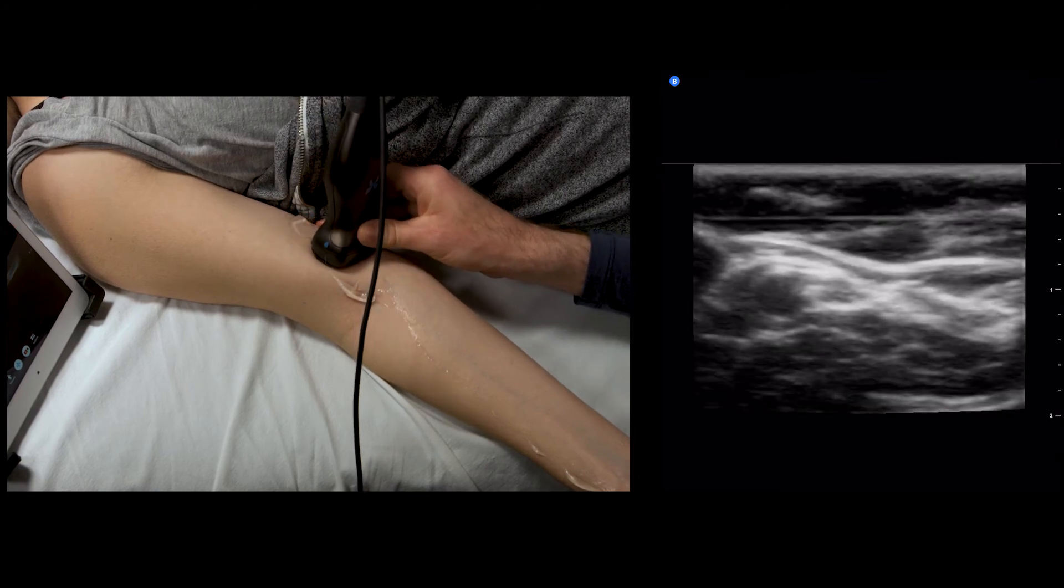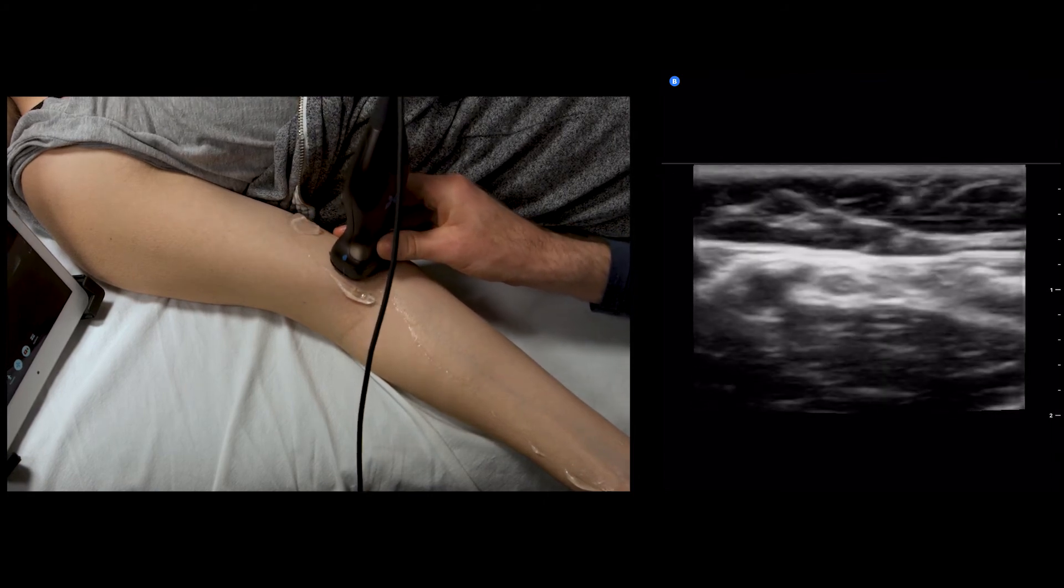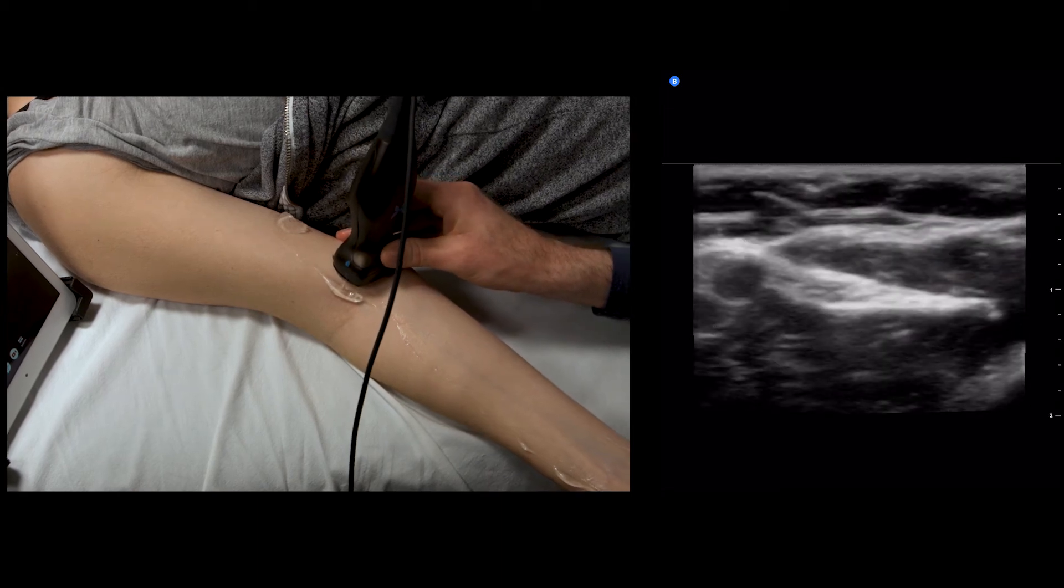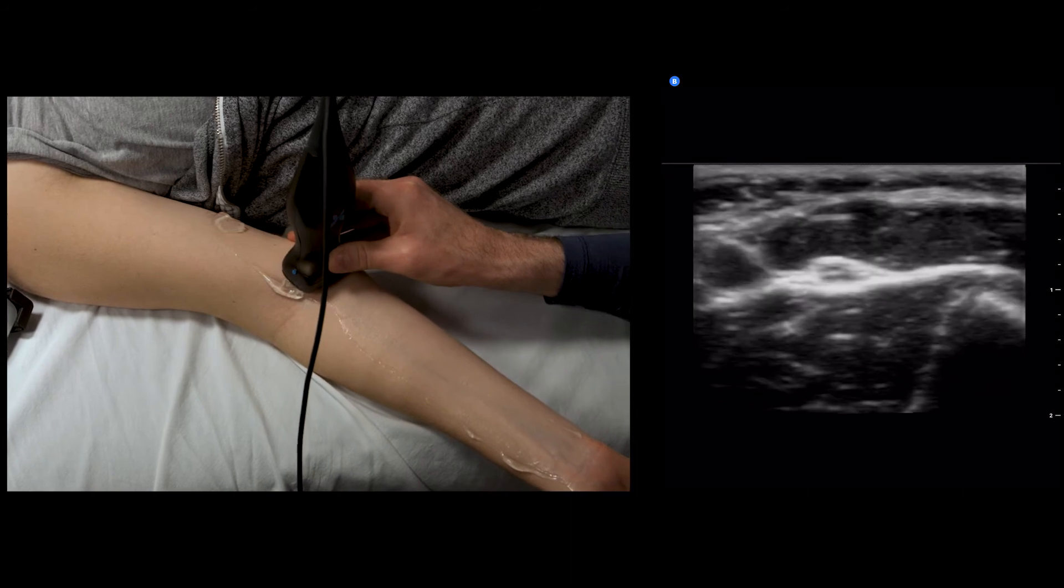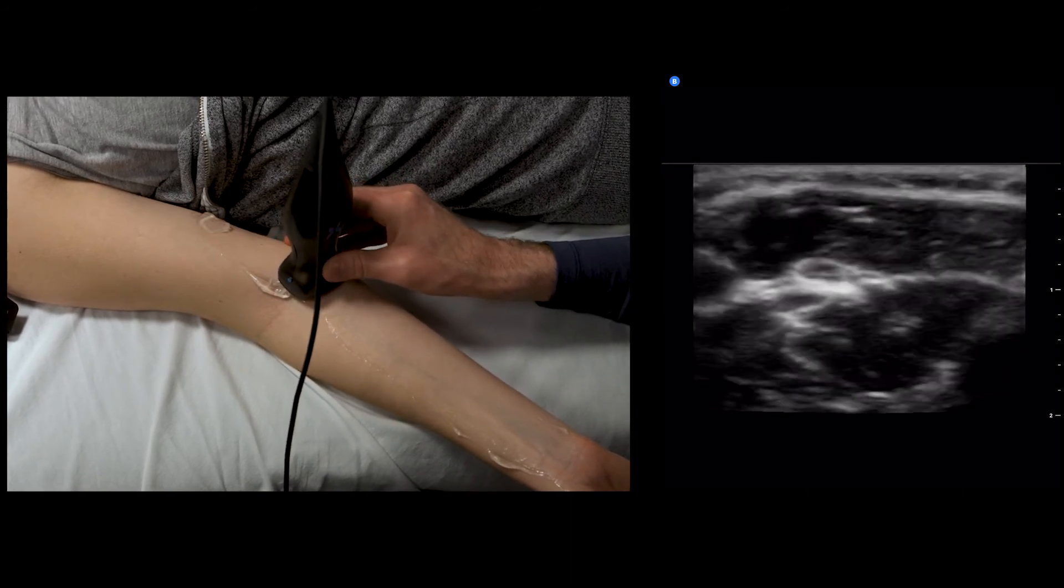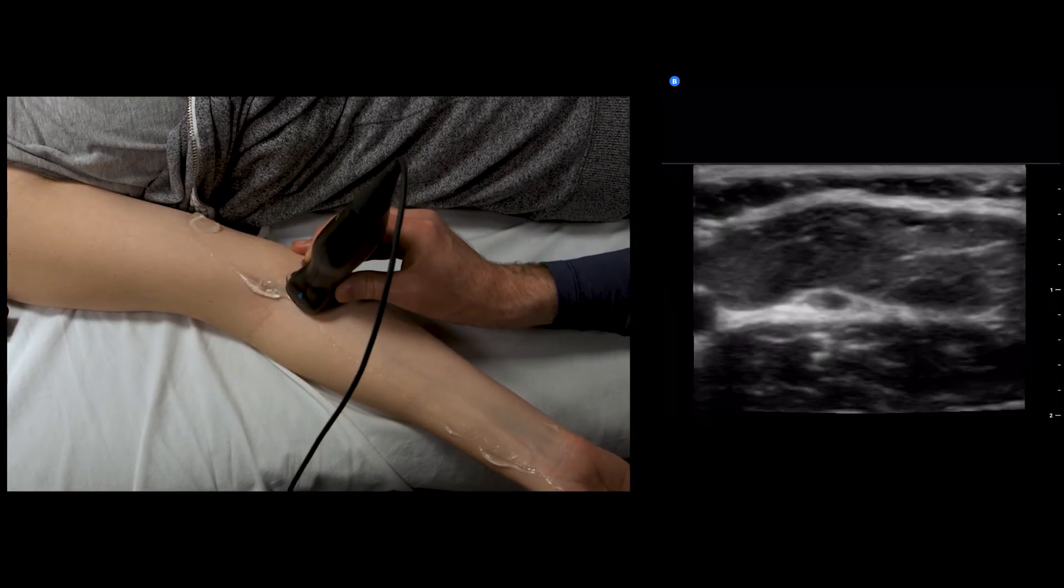So again, we'll follow it distal. Now it's going to descend deep to pronator teres. It's dropping down.